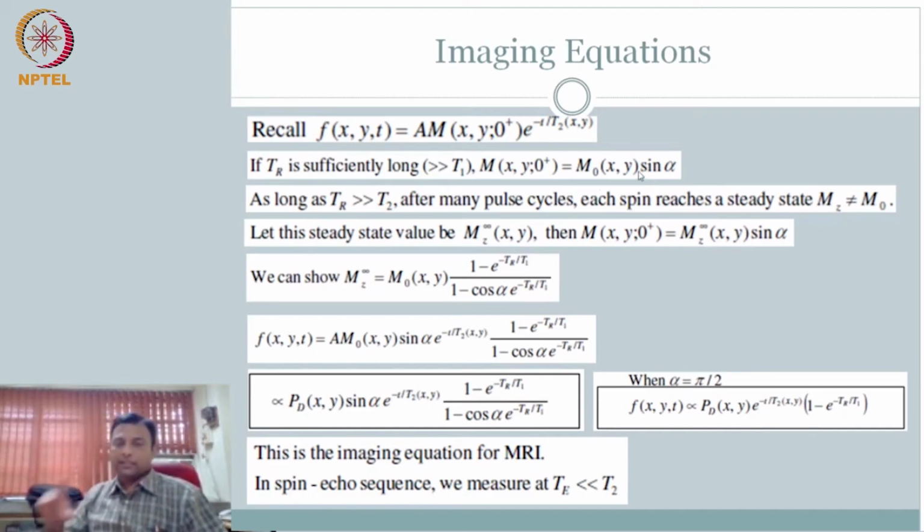But notice here, this is good. Whatever we have covered so far is good when you do it once. There is an important concept that we will reveal now. What we want to do is repeat it again and again and again, right? That is, this is your magnetization vector. I am pushing it to the transverse plane. Again, it comes back. Again, I am pushing it. Repeating the experiment with different settings, right?